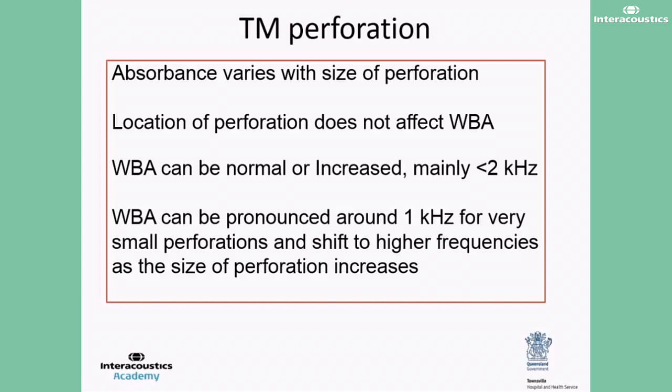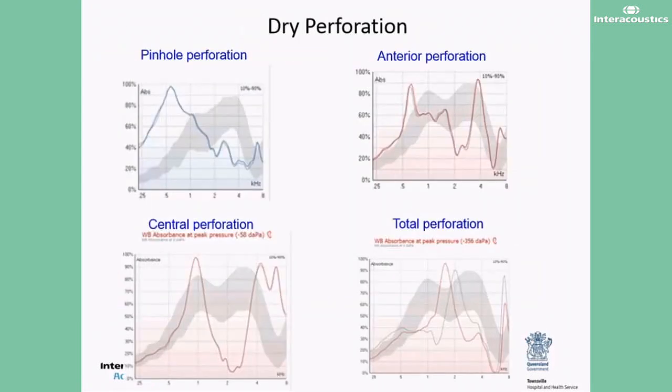This slide shows a range of wideband absorbance patterns seen in ears with dry perforation. As said earlier, location of perforation does not affect the absorbance much. While there is no generic pattern with various perforations, slightly pronounced absorbance in the low to mid frequencies can be seen as the size varies from pinhole to a total perforation.